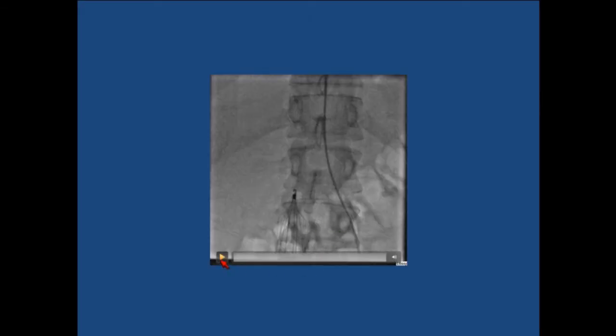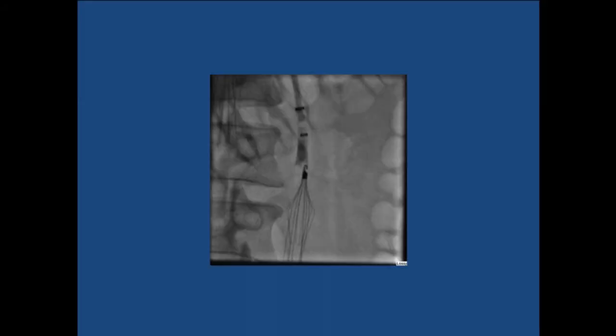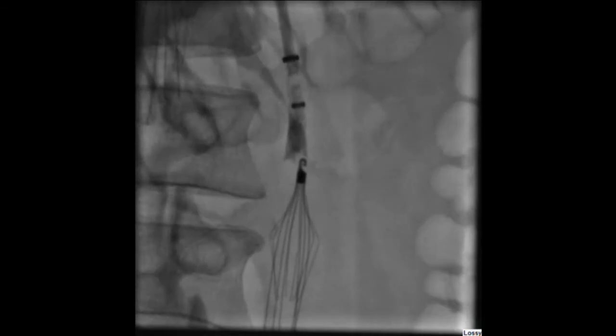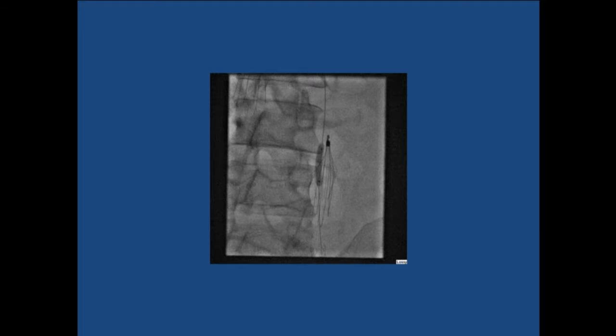We advance a glide catheter over a glide wire down to the level of the left-sided IVC filter, but we come to this obstruction where you can see the tip of the catheter is impinged there. We advance a 12 French Denali retrieval system and shoot an angiogram, which shows complete obstruction superior to the left-sided IVC filter. It looks like there's even maybe some calcification there. So we try to advance a .018 system with ballooning through the struts. You can take my word for it, after more than an hour of trying to get this thing out, we couldn't do it.